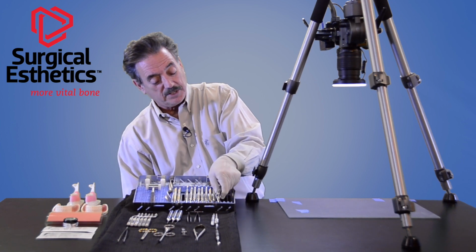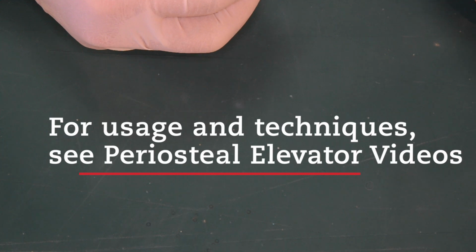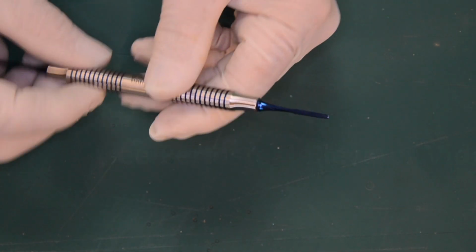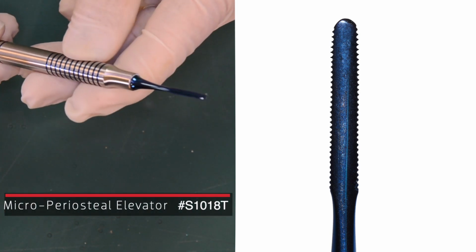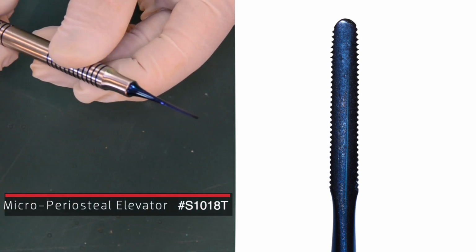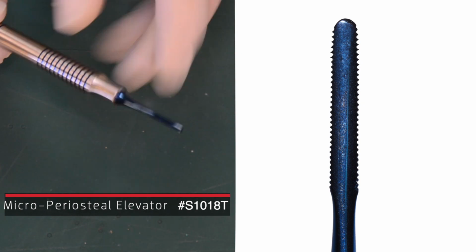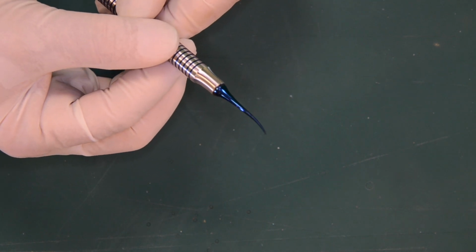Our next set of instruments are the periosteal elevators. The initial periosteal elevator that we really like is a micro periosteal elevator, and you can see by the end it has a very small tip. It has a serrated tip, which really helps to raise the tissue. One side is straight, the other side is slightly curved.